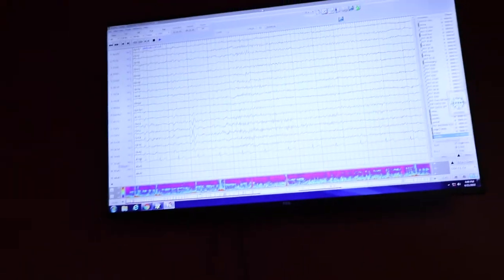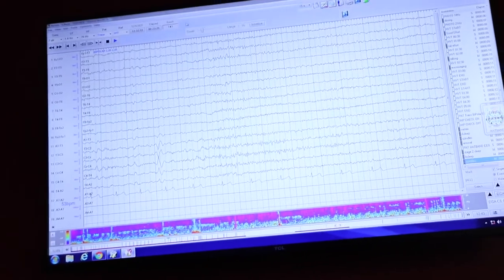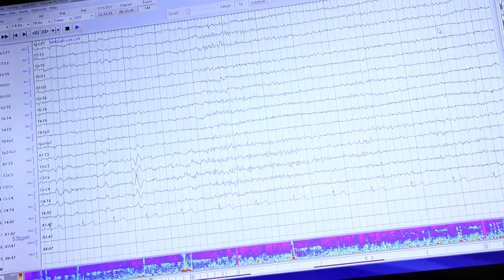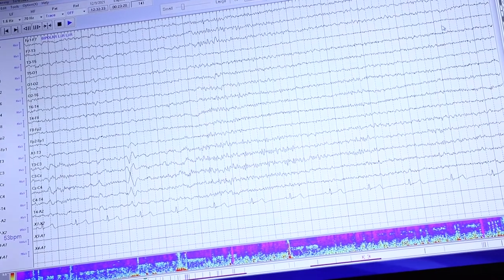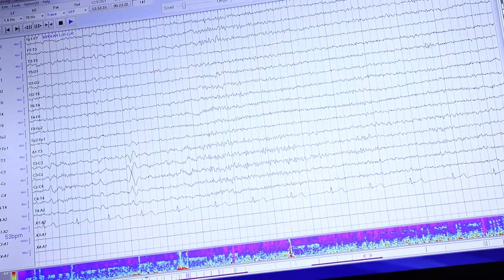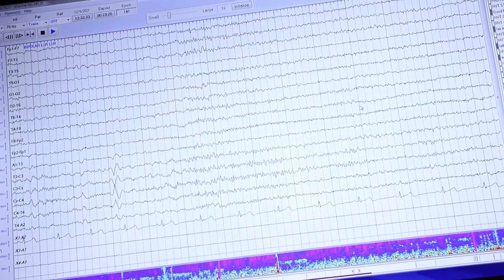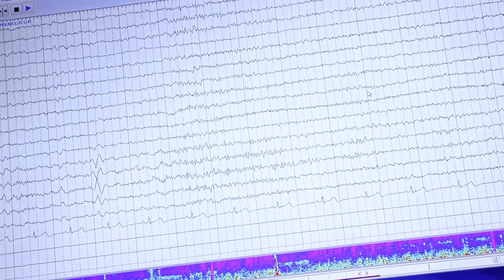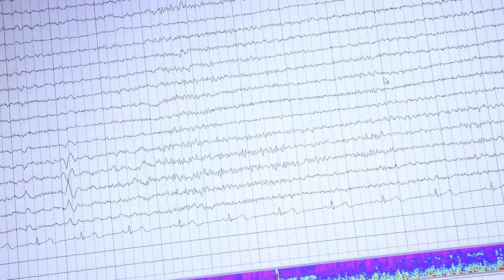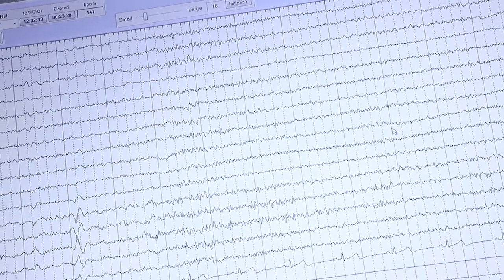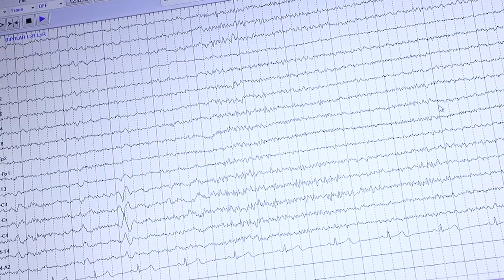As you can see on the screen now, some of the markers of sleep — as you know, you have several different stages of sleep. You have Stage 1, which is drowsiness. That's when the alpha starts to drop out and it'll be a lot less than usual.